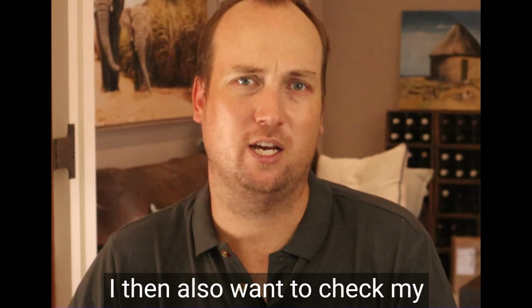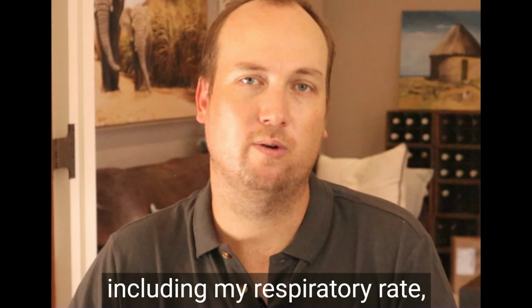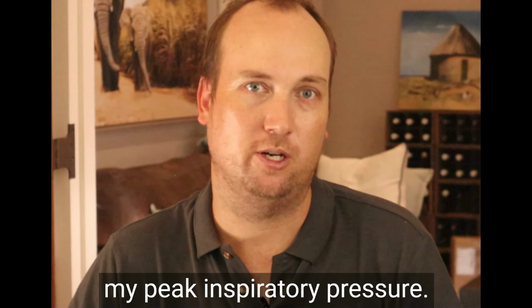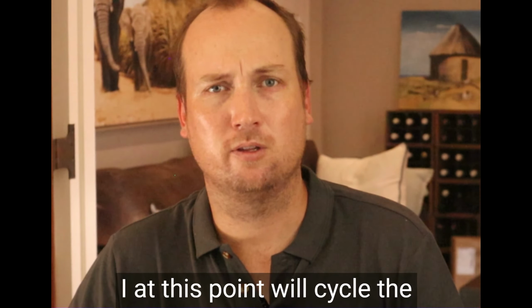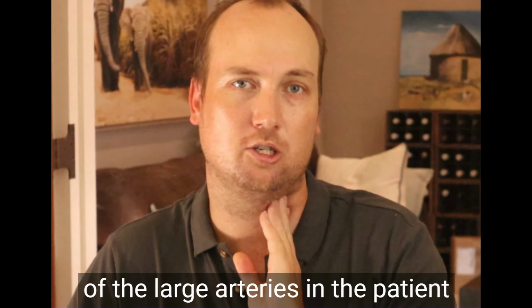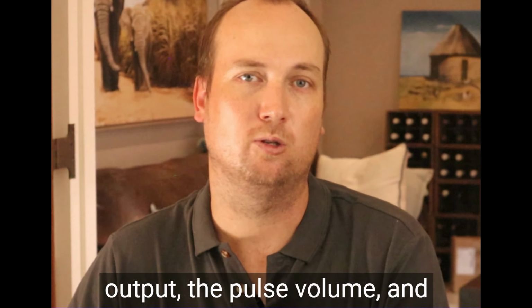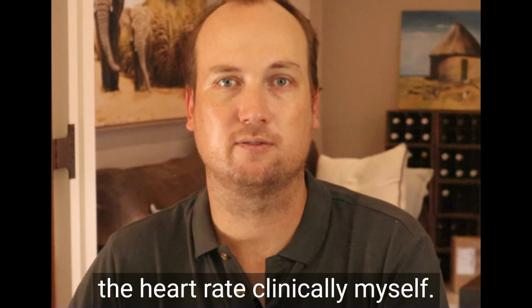I then also want to check my overall ventilation parameters, including my respiratory rate, my tidal volumes, my PEEP, and my peak inspiratory pressure. At this point, I will cycle the non-invasive blood pressure, and I will probably actually palpate one of the large arteries in the patient so I can get a sense of the cardiac output, the pulse volume, and the heart rate clinically myself.